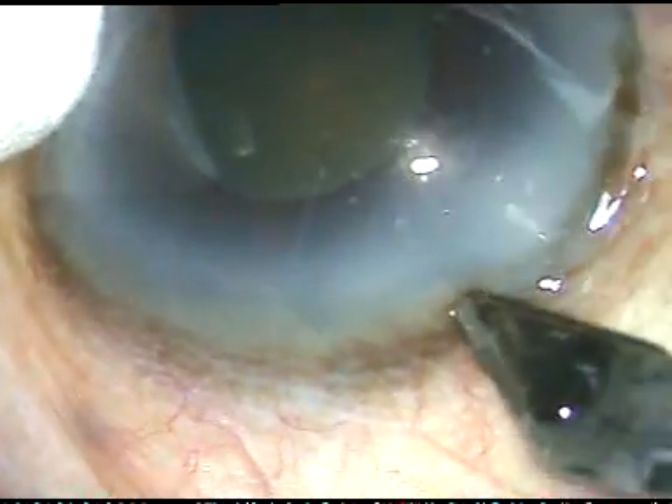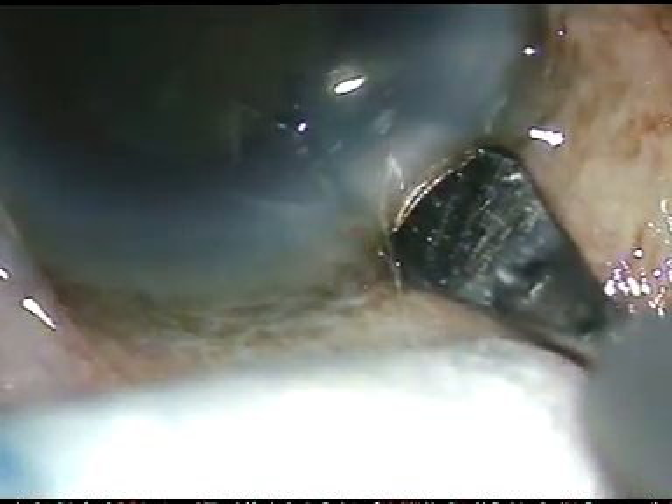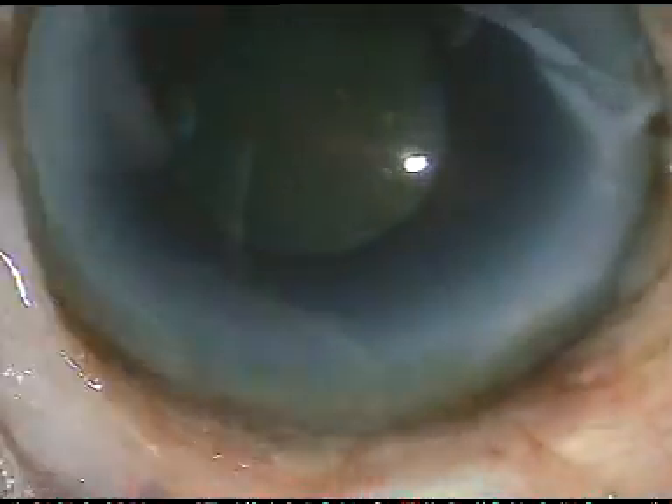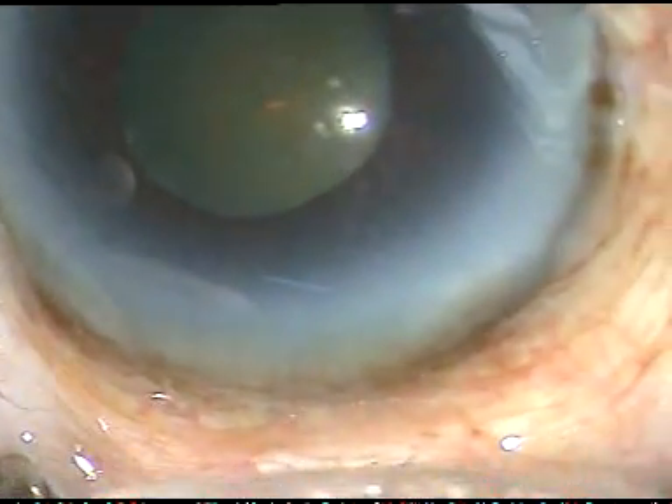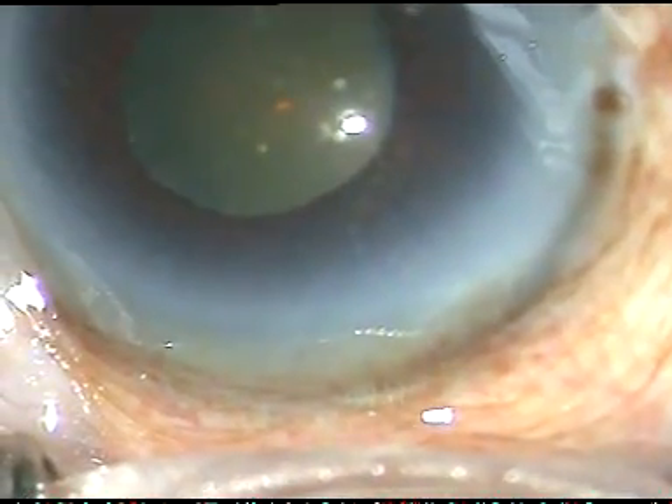Friends, this eye of a 76-year-old lady has cataract with pseudo-exfoliation, small pupil and weak zonules. I have taken up this case for surgery. Let us see how the surgery went on.